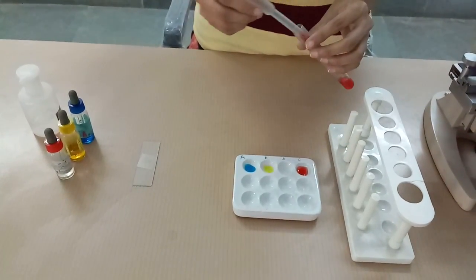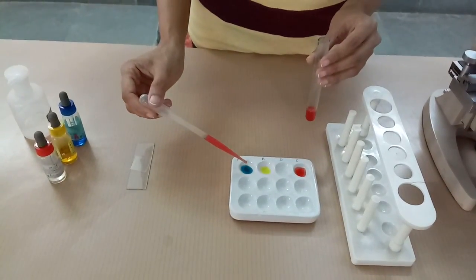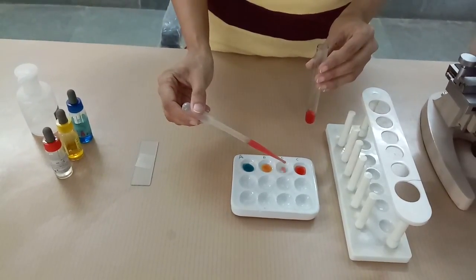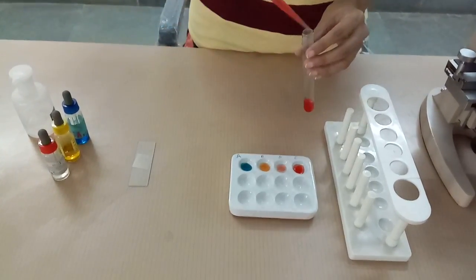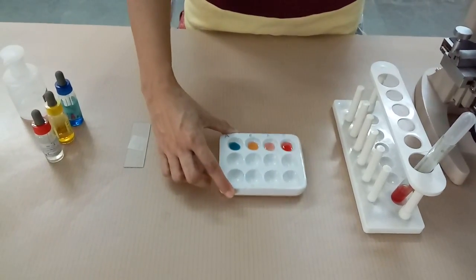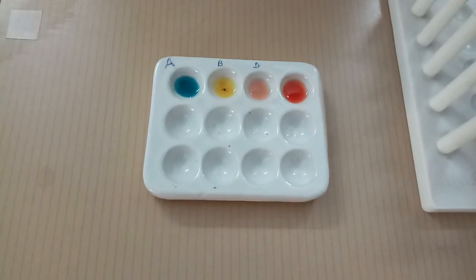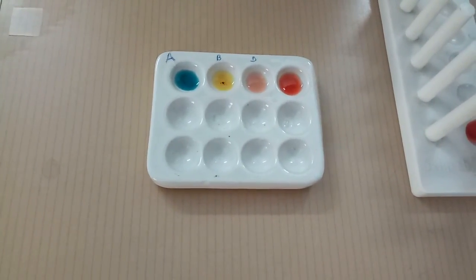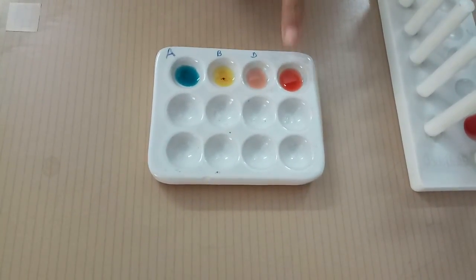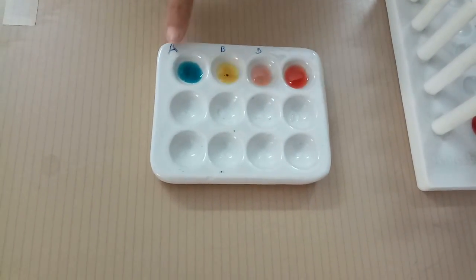Add a drop of red cell suspension in A, B, and D. Mix it by gently shaking the tile and wait for 5 to 10 minutes. Check for agglutination and compare it with a control sample. You can see we get agglutination in B, not in any other.